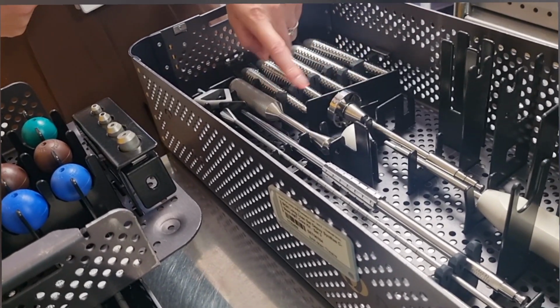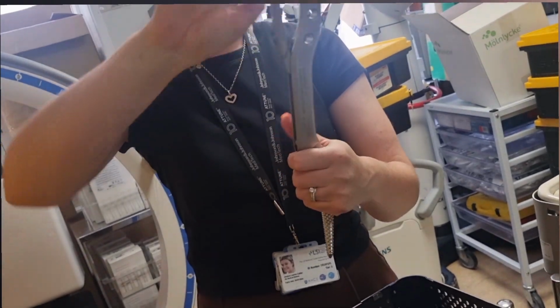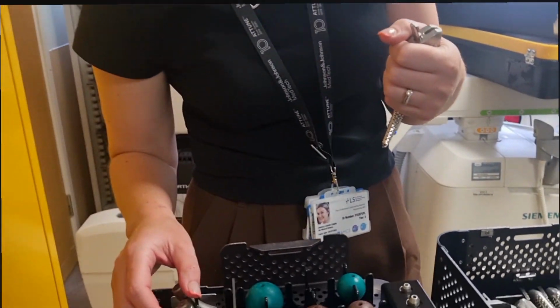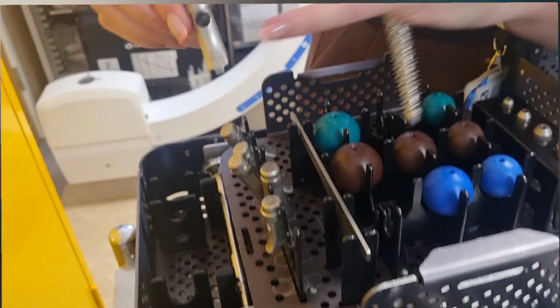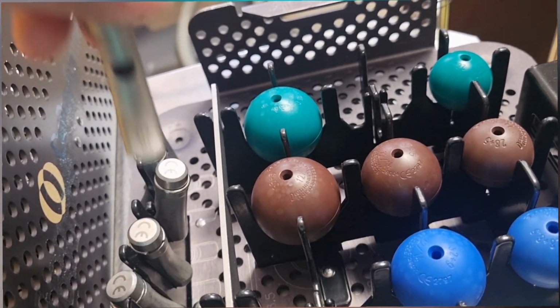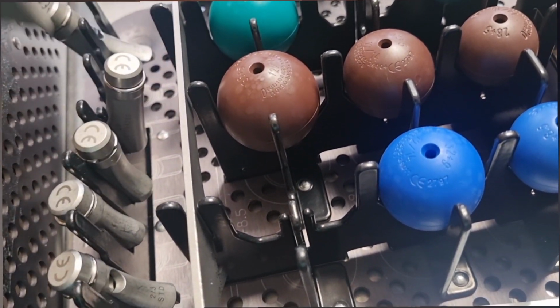Let's say you'd broach up 1, 2, 3. And then obviously that would be in the femur. So you've got your neck trials here. If this is a 3, you're going to need the 2, 3. Let's see, 0, 2, 3 standard. There's only standard and high offset. So that's 2, 3 high offset. This one is 2 to 3 high offset, and then 0 to 1 high.